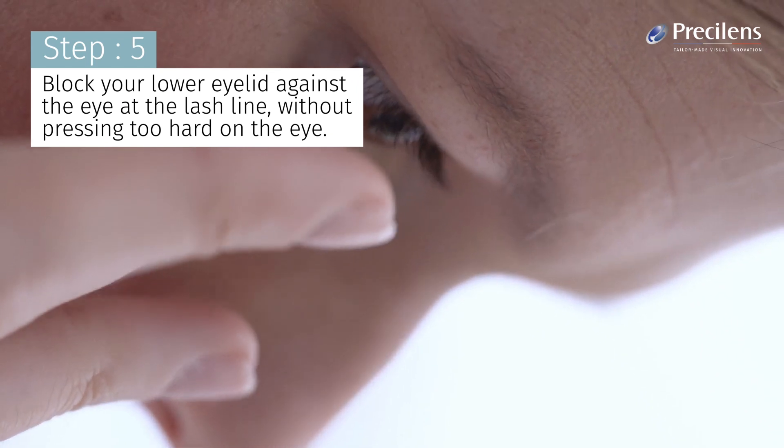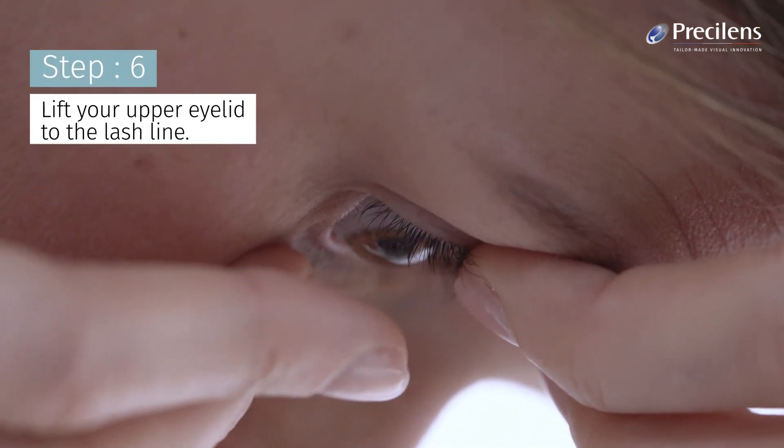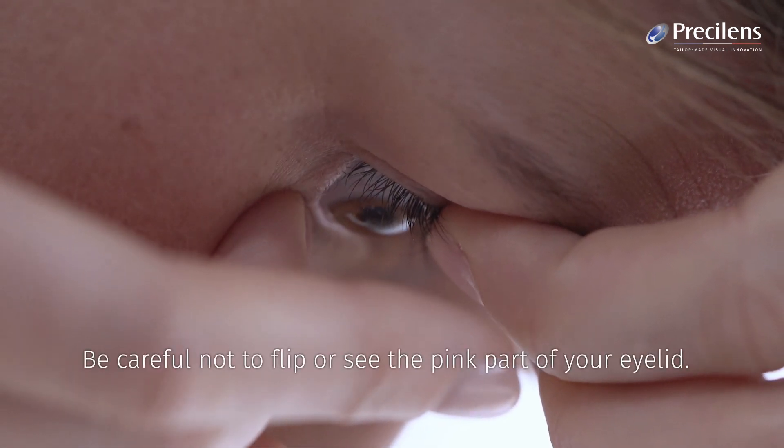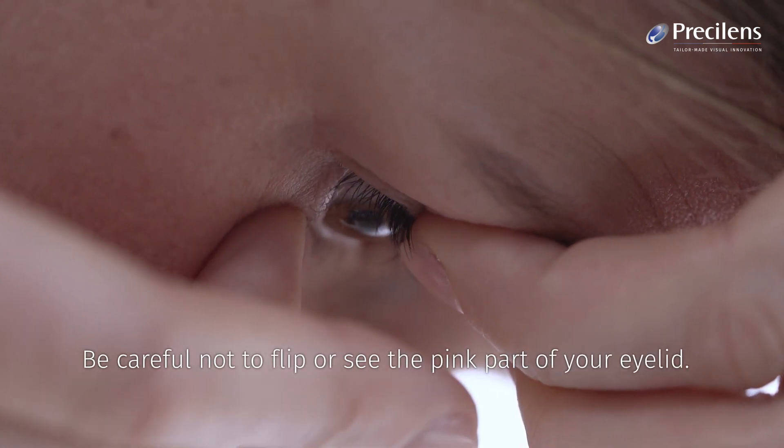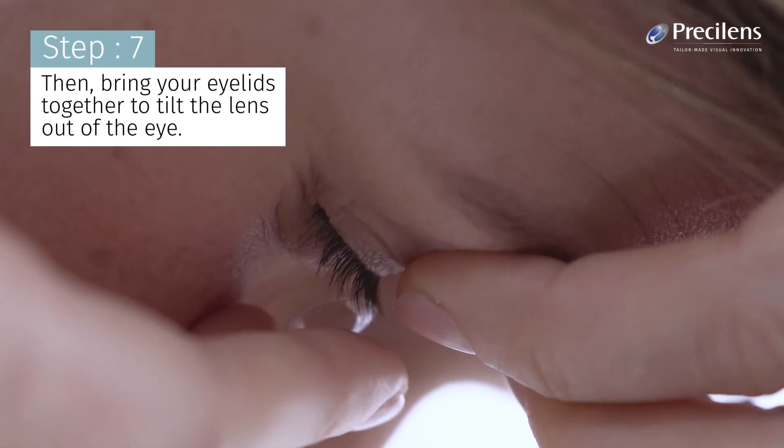Block your lower eyelid against the eye at the lash line without pressing too hard on the eye. Lift your upper eyelid to the lash line. Be careful not to flip or see the pink part of your eyelid. Then bring your eyelids together to tilt the lens out of the eye.